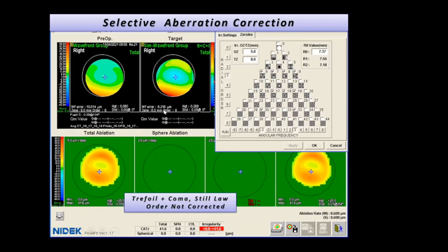No, what is left? So much is left in the high order. Okay, so there is not enough tissue for you. This patient may have advanced keratoconus, there's not enough tissue, and you don't want to give him a cornea graft, or he doesn't want a cornea graft for whatever reason. If you give him glasses, he doesn't see, the high order is so high. So with minimal tissue, you correct the higher orders, and then let him have glasses.